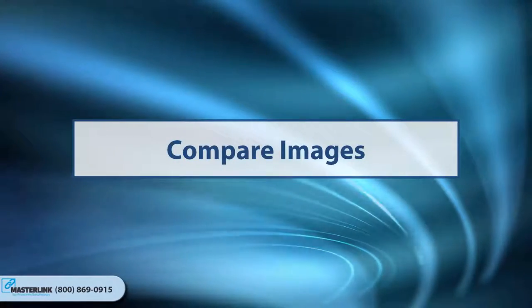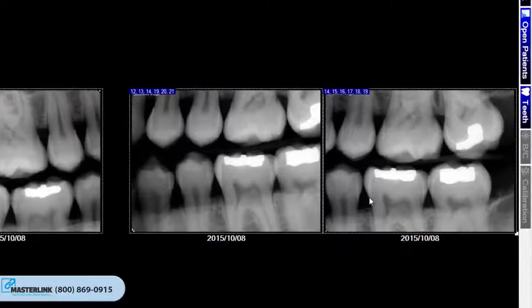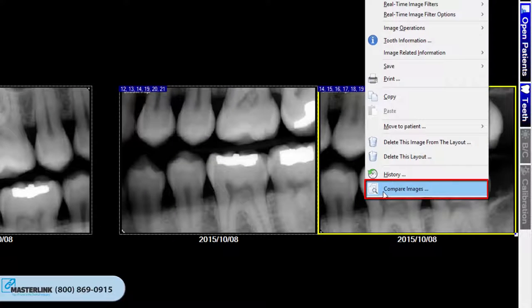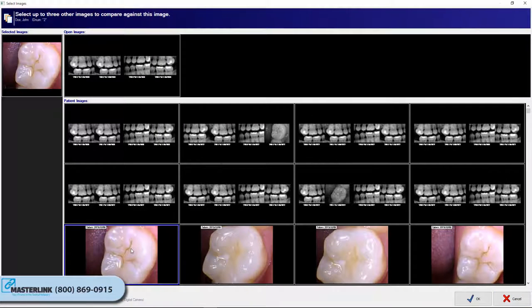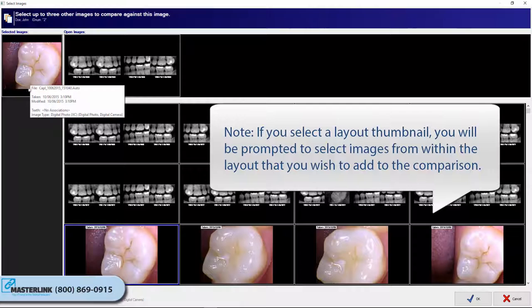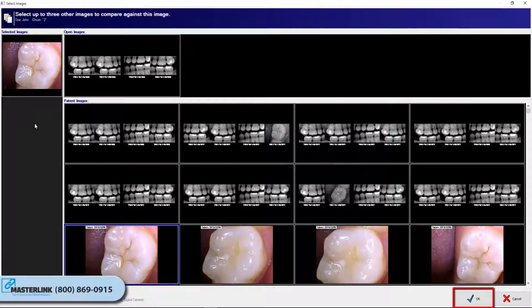Compare Images. The Compare Images function allows a user to view up to four images in a side-by-side comparison window, and any of the full-screen view functions can be applied to one or all of those images. To compare multiple images, open an image, right-click on it, and select Compare Images. A new window will appear showing images for the patient. Select the images to be compared by left-clicking on their thumbnails. If you select a layout thumbnail, you will be prompted to select images from within the layout to add to the comparison. Click OK and the images will appear side-by-side.